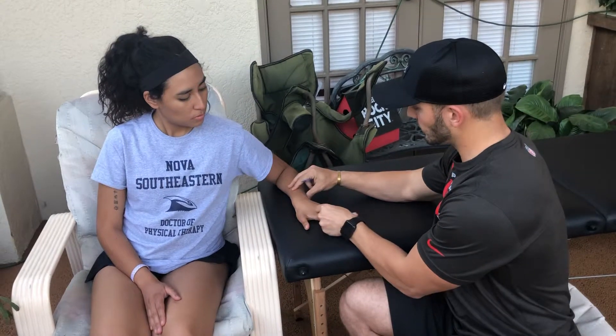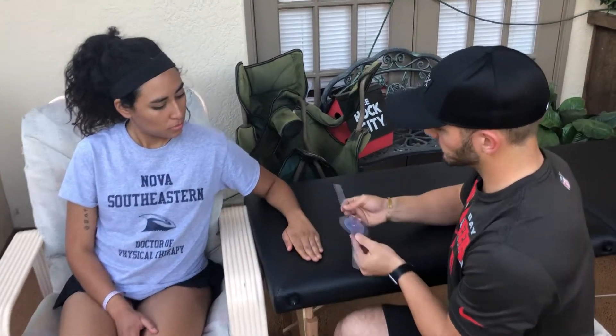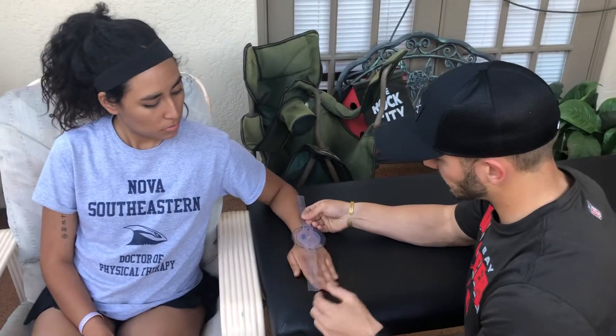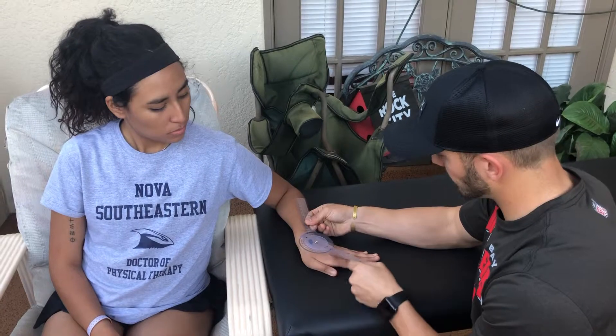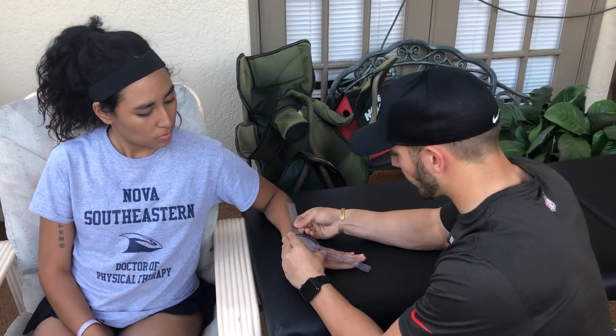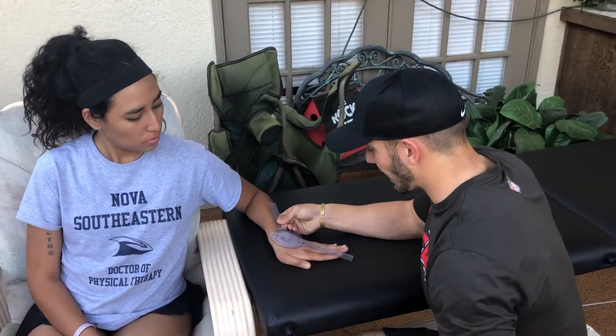Next, we'll go the other direction — ulnar deviation. Same landmarks. Go ahead. And I have 59 degrees. The AOS norm for this is 30, so a little bit more.